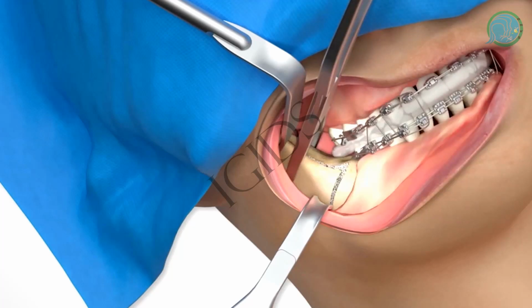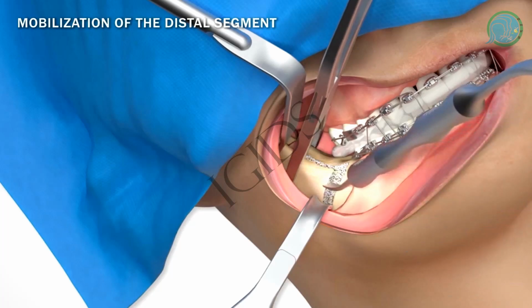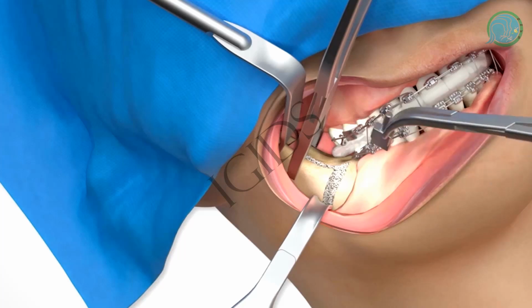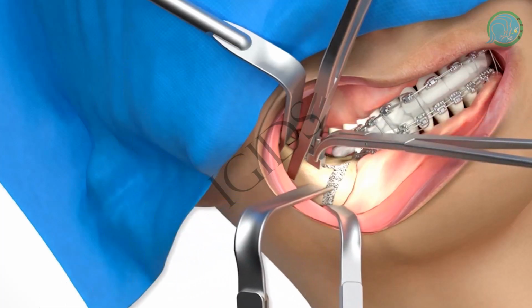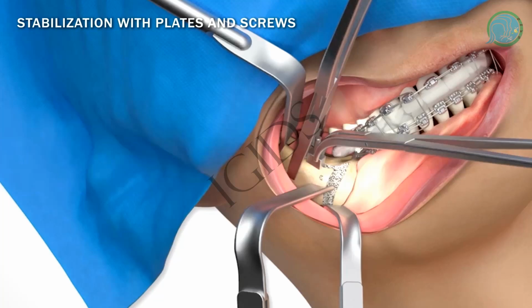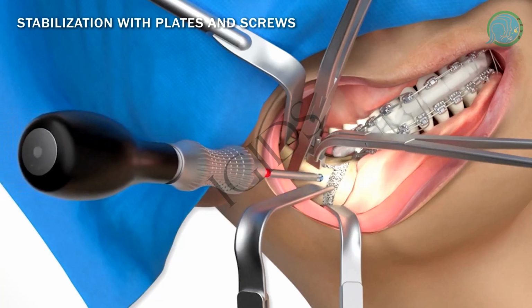The proximal segment is gently moved into the fossa with the use of a ramus pusher, a wire director, or a periosteal elevator. We then fix the 2 bony fragments together. Bicortical position or lag screws or plates with monocortical screws as well as resorbable screws are used to stabilize the segment.